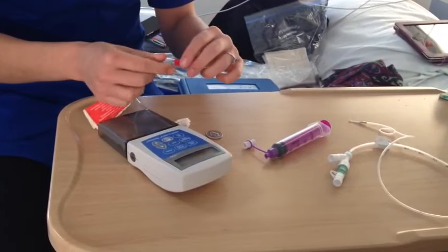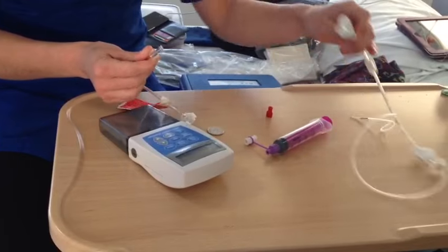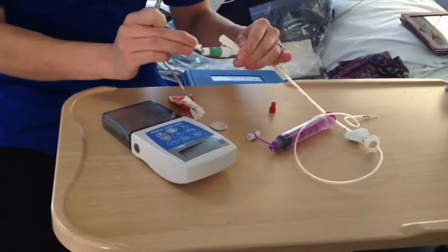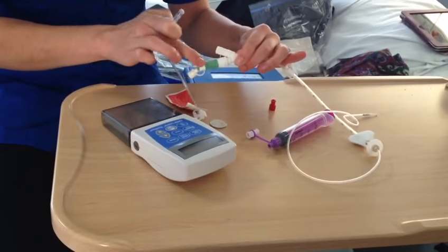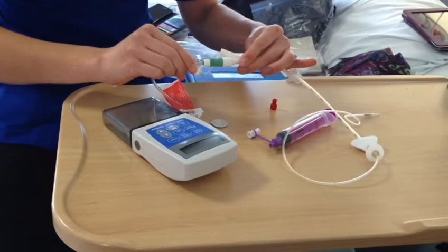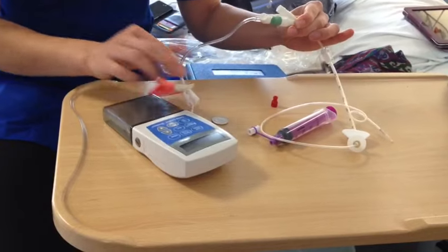Then you can place the pump down, take off the red cap and connect it to your tube. Always connect it to the green part of the tube, and always twist the part of the tube going to your pump.